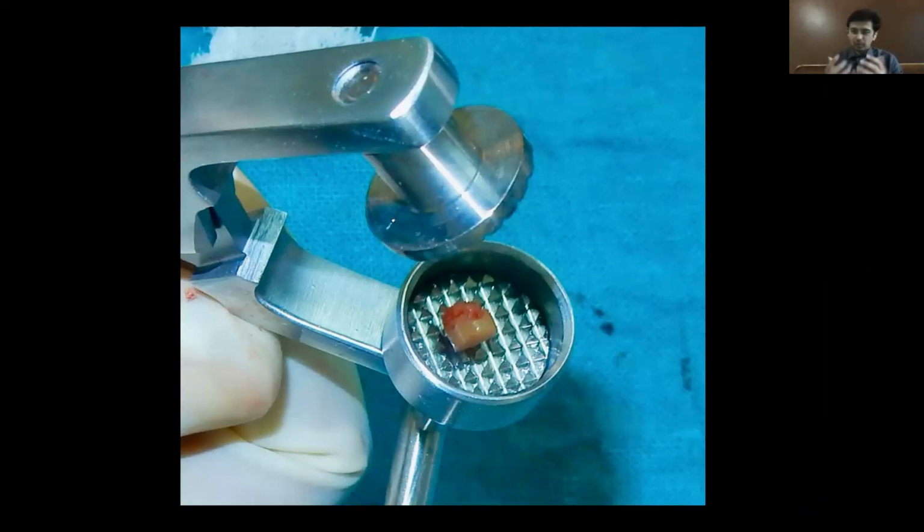Never, from my point of view, put bone graft after procurement of the symphysis bone graft. Consider it from the patient's point of view. The patient was telling you not to use allograft, xenograft, or alloplast, so which bone graft would you ultimately be putting in? But my point of view is that it is a completely circumscribed defect. Complete healing occurs. Only slight edema occurs in the first couple of days.